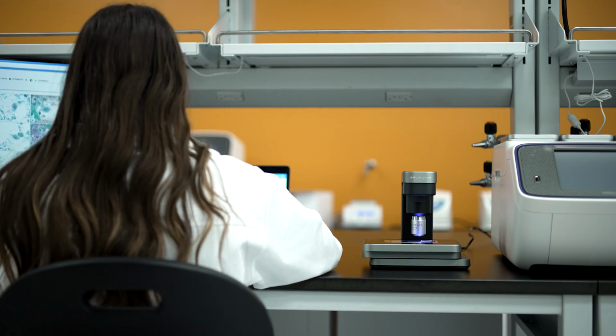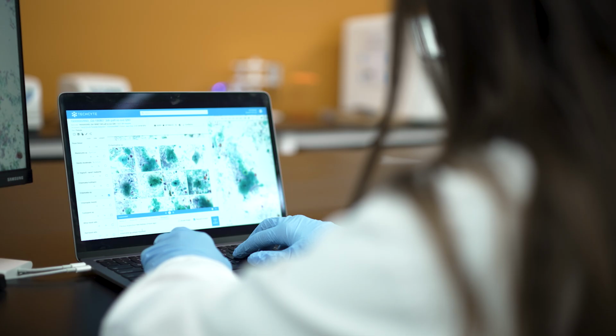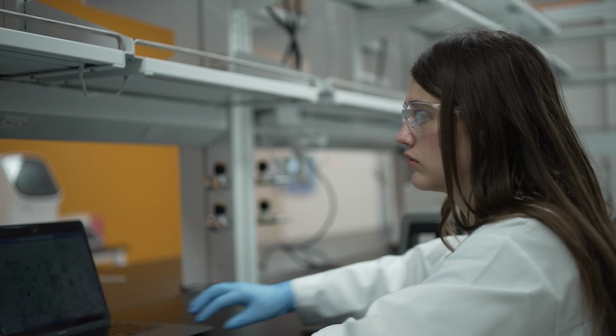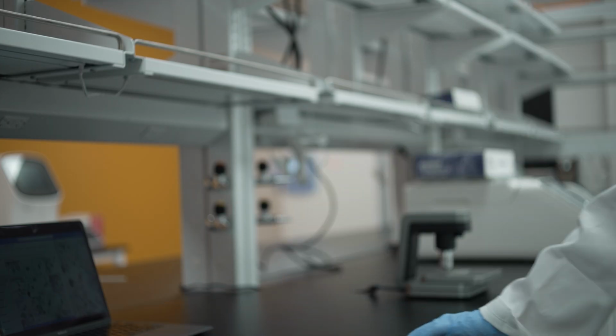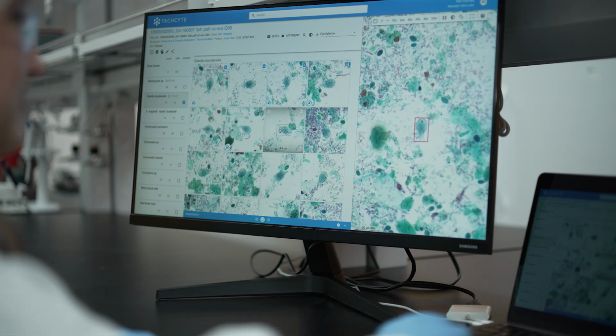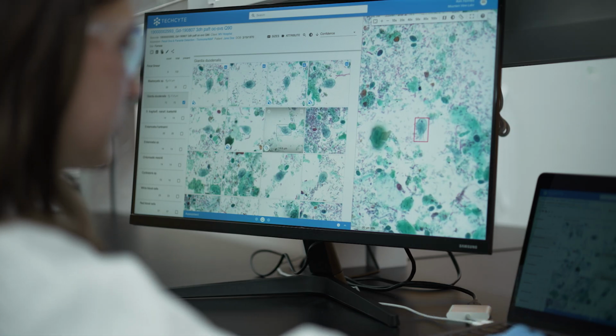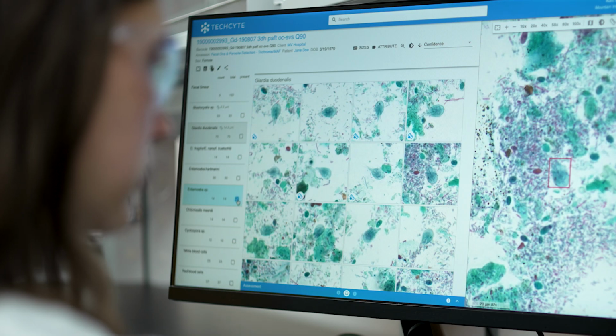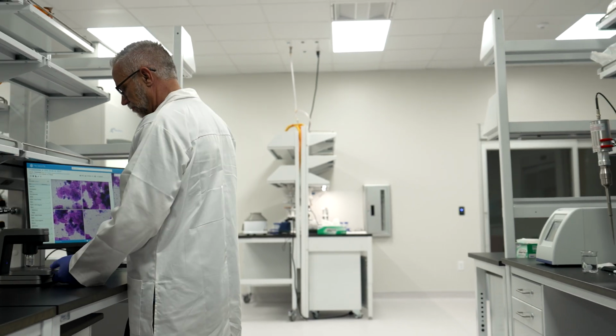We used what's called supervised learning. You would take a slide and scan a certain area, and then you say, okay, these 100 things are Giardia. Then you send the slide back and you tell the software, this is what Giardia looks like, find more of these. And it comes back with maybe, say, 1,000 examples of things it calls Giardia. You confirm the ones that are correct. You correct the ones that are wrong, and you do this over and over again, and the software eventually gets better at finding true parasites. The employees are spending more time looking at actual positive smears.